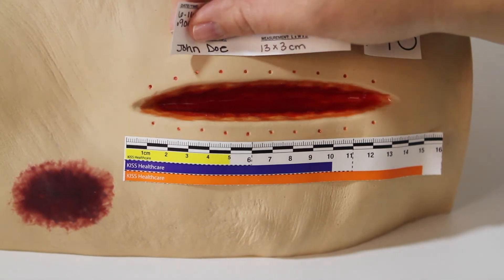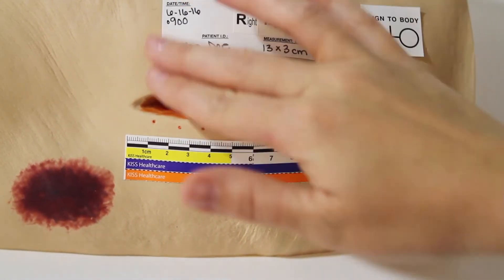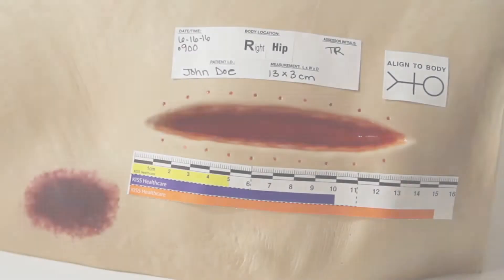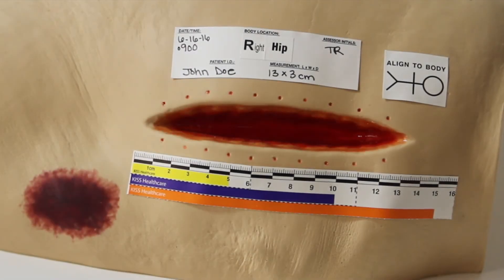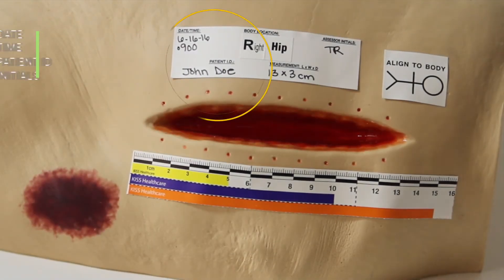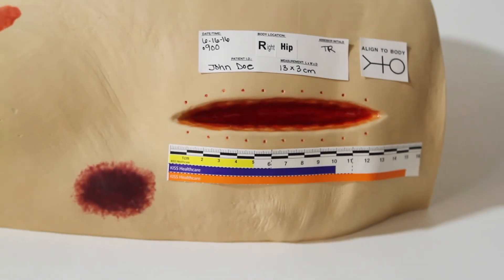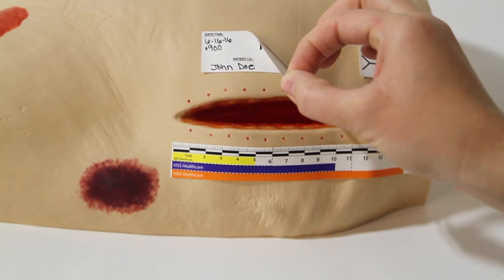A sharp fine tip permanent marker works best. Include the date, time, patient ID, and your initials. You are ready to take your picture. After you have taken your photo, remove the ruler, note label, and stick figure from the patient.